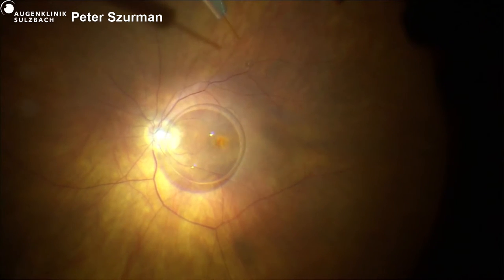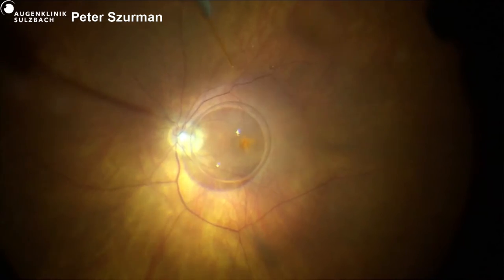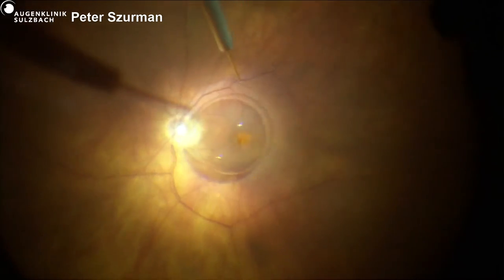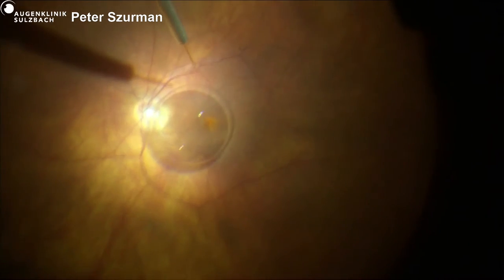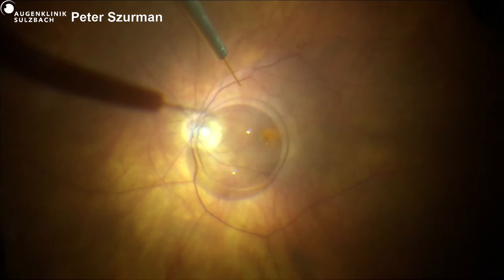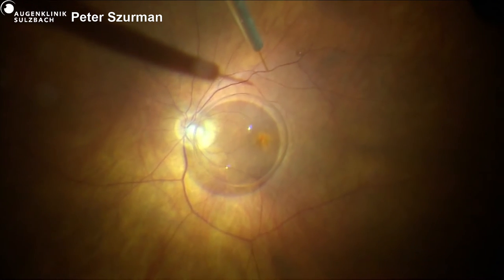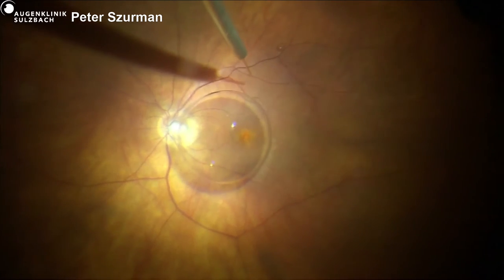And Dr. Barak, we will come right back to your case, but Dr. Szurman, can we go to room two to see the bleb formation? Peter, we are rejoining you. We see you've put some PFO in the eye. Yeah, perfect. So now we do the decisive step. We use three or four subretinal BSS blebs to approximate the edges.